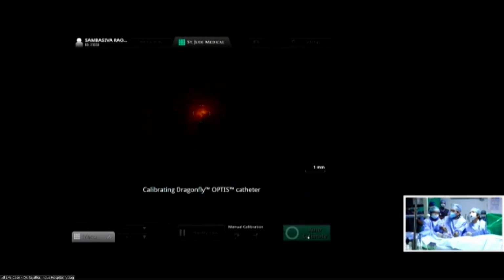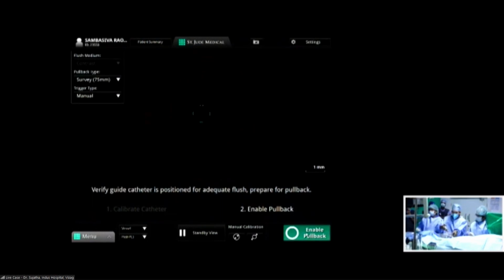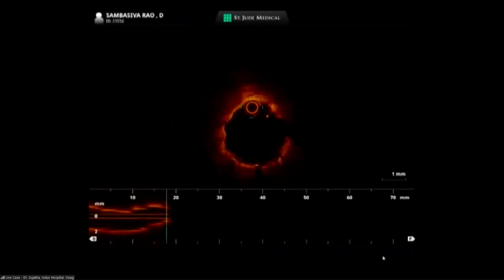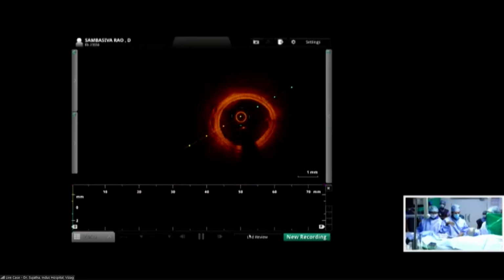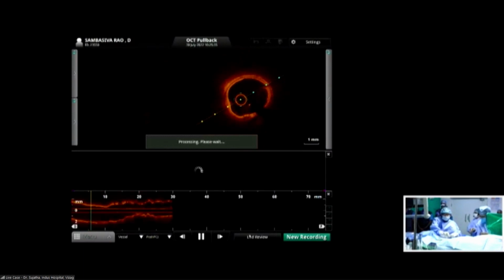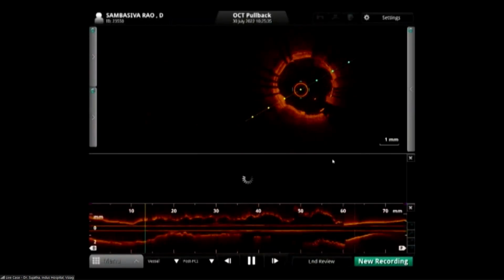Check pressure. We are inside. Okay. So we are taking the OCT run. So you can see the OCT run and tell me what I'll be doing. Krishna will be showing us what we've done.